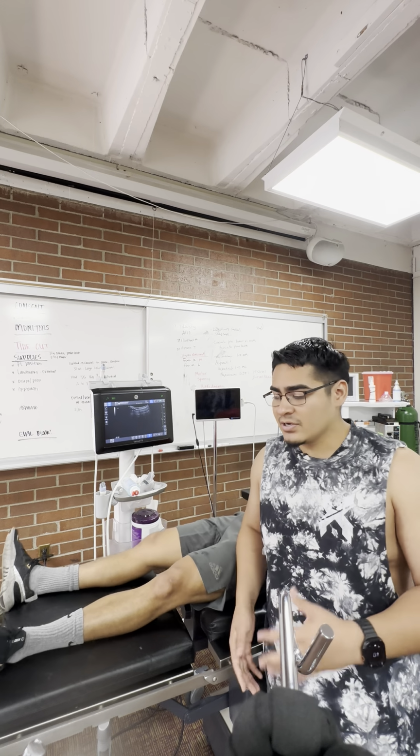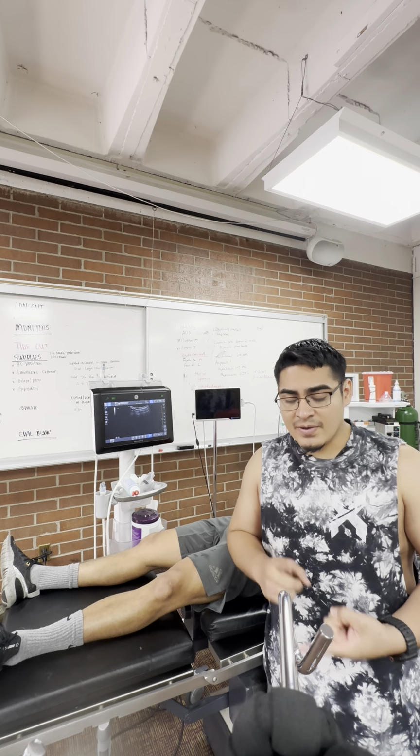So right now, the biggest issue with the patient is their lack of mobility. They're having a really hard time turning in bed, difficult with repositioning. And so this PENG block will be covering the femoral, as well as the obturator and accessory obturator articular branches. And so this will be motor sparing. They will pretty much only be sensory, so that'll really help them just with the pain rather than them losing that strength and not being able to do physical therapy here in the next couple of days.